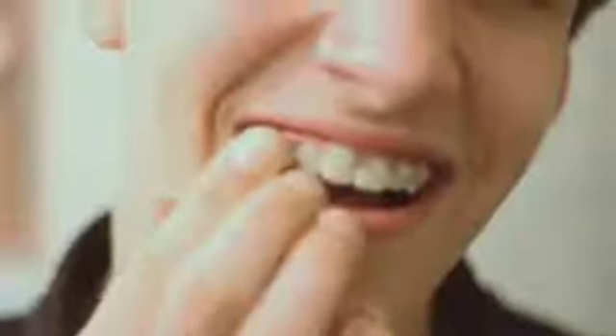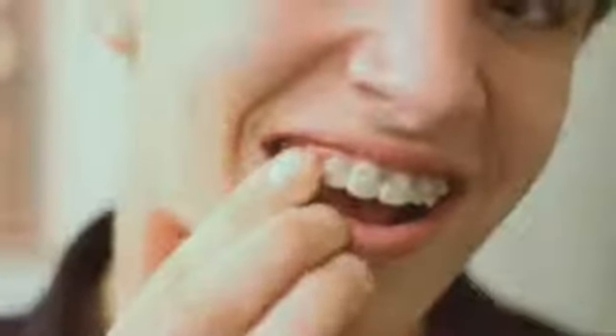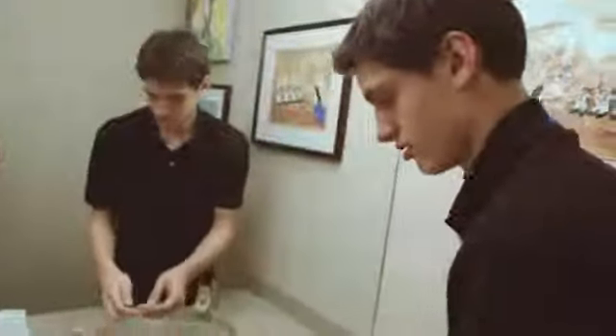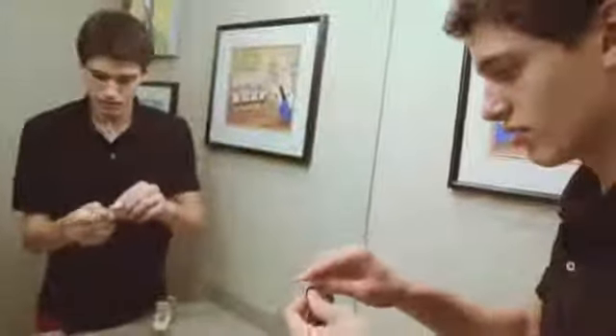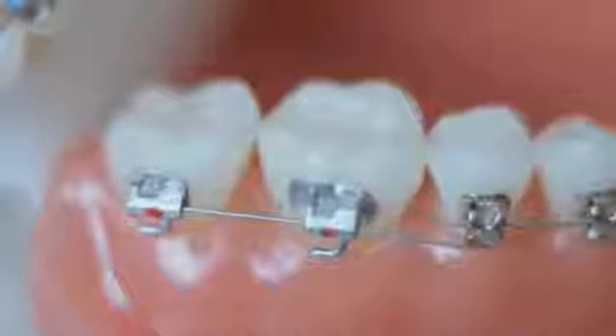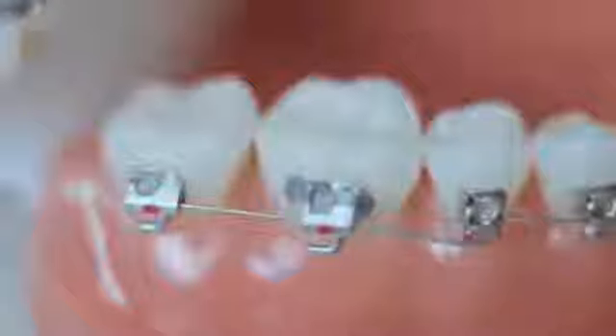You can use wax to cover the wire. Just make sure the area is dry and apply wax like this. You can also clip the wire closest to the next bracket if you can't get relief. The wire can be clipped between any teeth or behind the last tooth. Once clipped, the free end can be slid out or just removed.